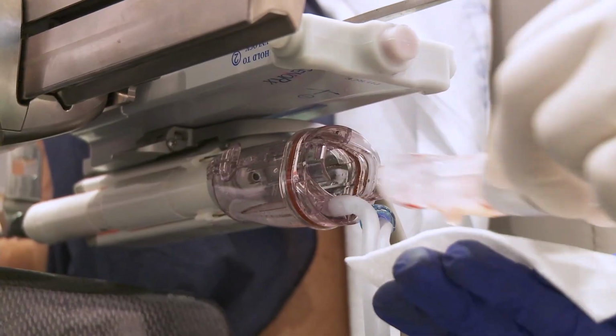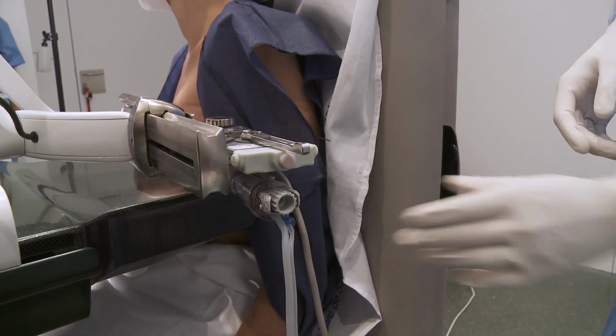Remove the sample basket and insert a new one if needed.